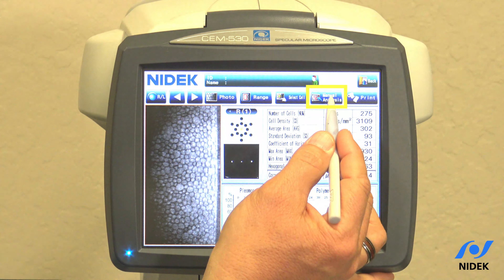Once you have a minimum of 10 cells that are completely surrounded by the center point counted cells, we can go into the OK tab.